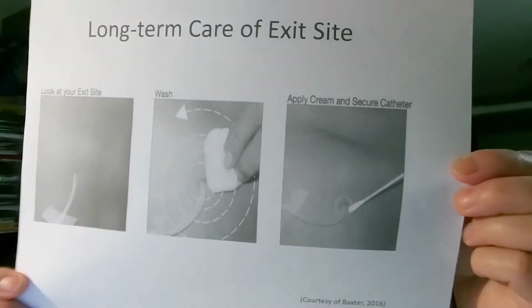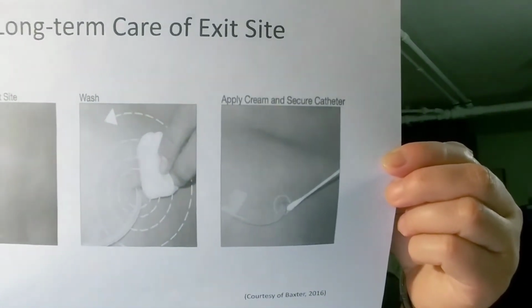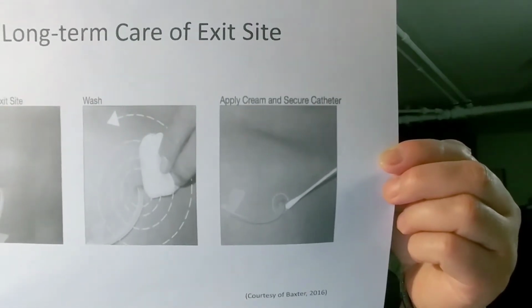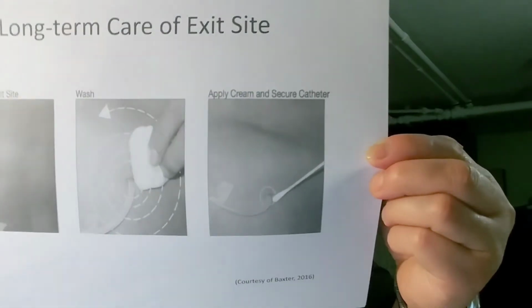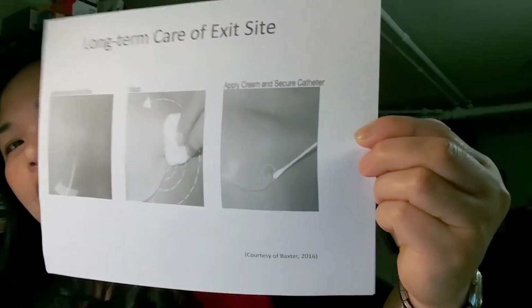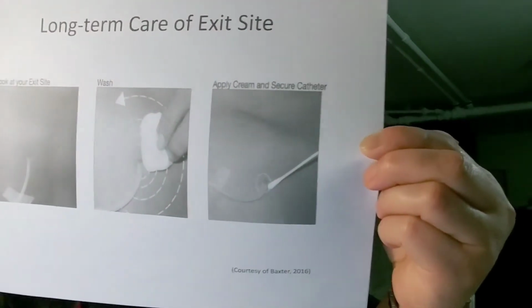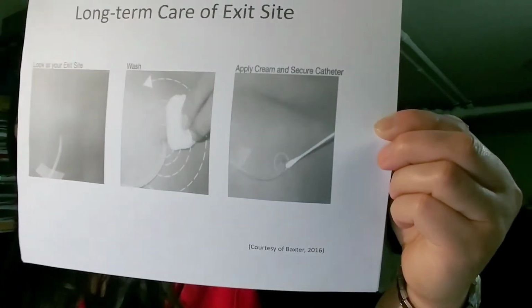If dialysis is required prior to the 2 weeks of healing, you may do APD with low volumes in supine position to prevent leakage. The protocol for cleaning the catheter exit site will depend on the facility, whether that is soap and water or povidone iodine. Harsh solutions should be avoided as they can cause skin damage, which can predispose to bacterial infection. Consider an antiseptic solution for immunosuppressed patients due to infection risk from normal skin flora.